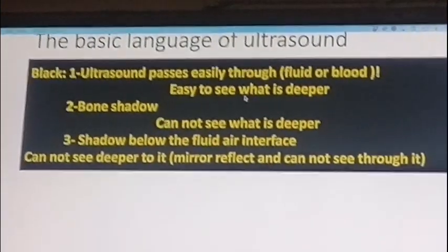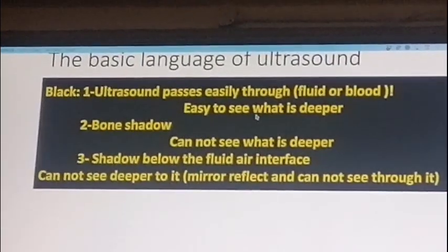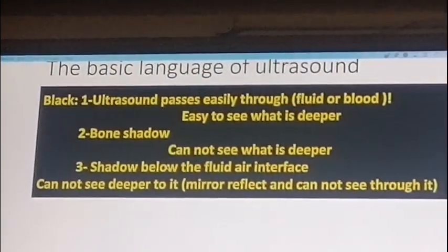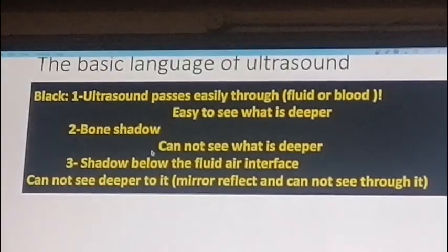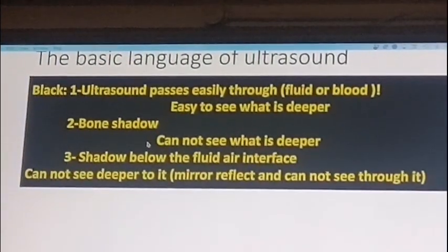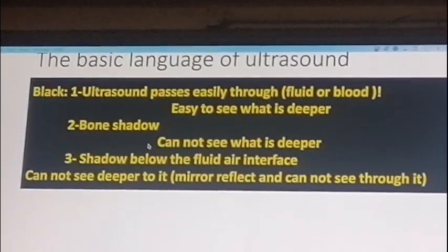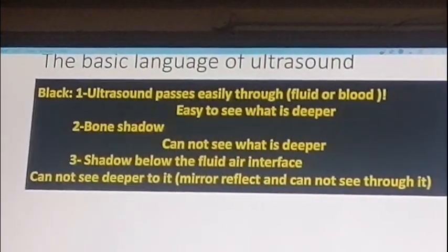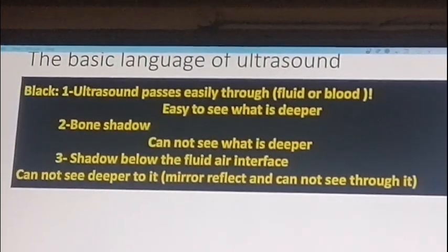That's moving blood. If it is extravasating, it will be... If the blood is hemorrhage, it's different. So you mean the ventricular hemorrhage? Yeah. No, it will not be black. Just to clarify this when we present, so white is white when you see inside.